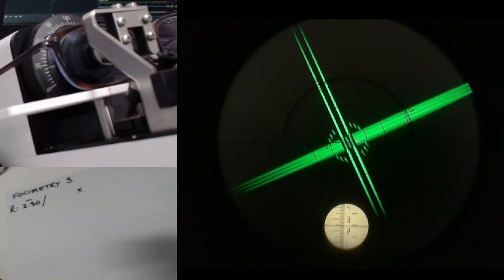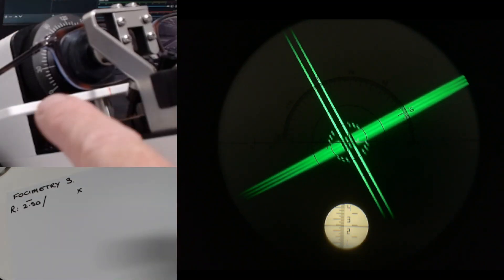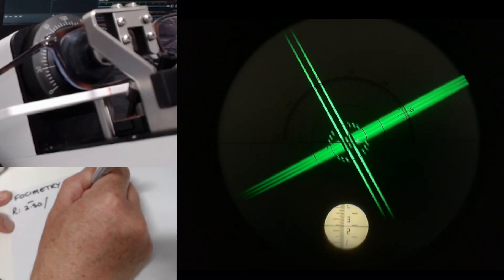We're going to check the axis now. I'm going to turn the axis scale and make sure that looks nice and clear. So that comes in at 30. That's really good — nice and clear.